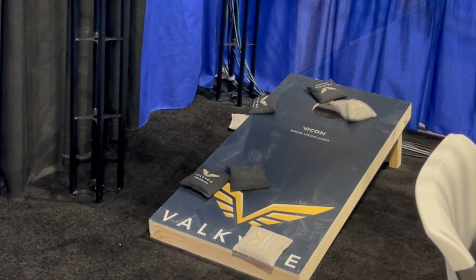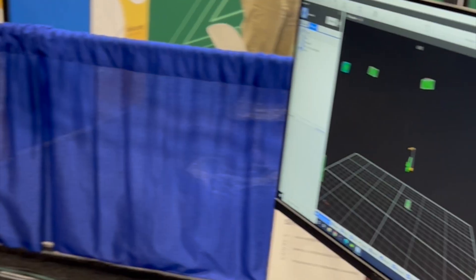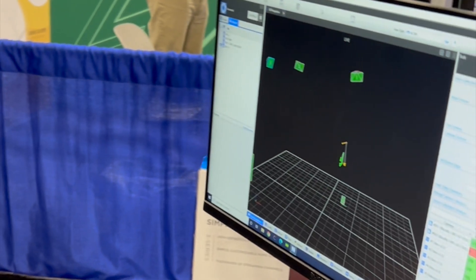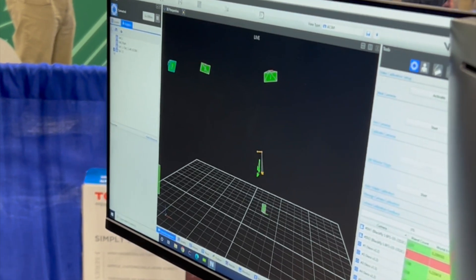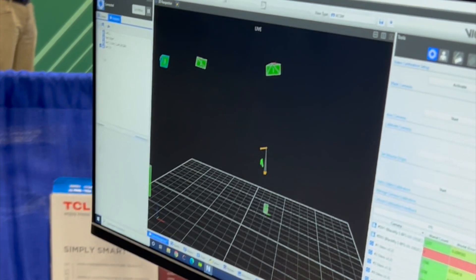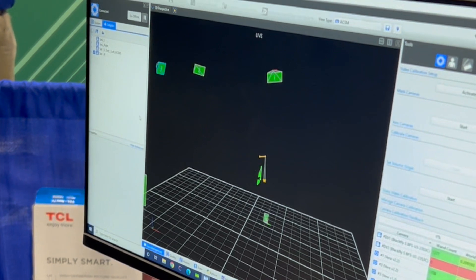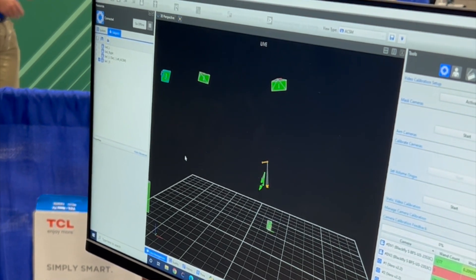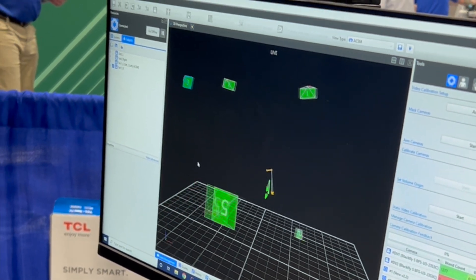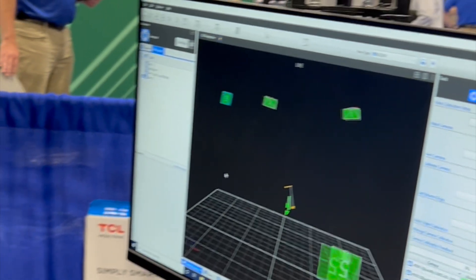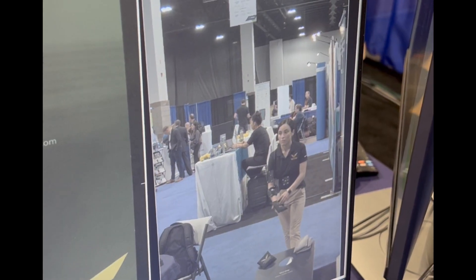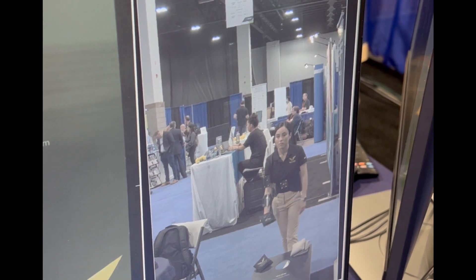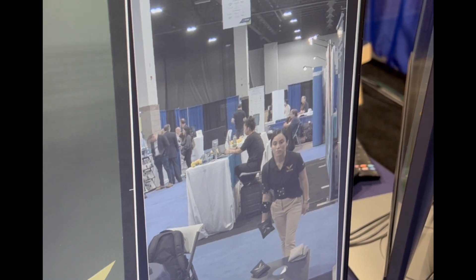Using ProCalc we were able to create a biomechanical model which defined a thorax, upper arm, and lower arm segments. We used this model to update the kinematic skeleton, also known as the labeling skeleton, to be able to provide shoulder and elbow angles in real time.